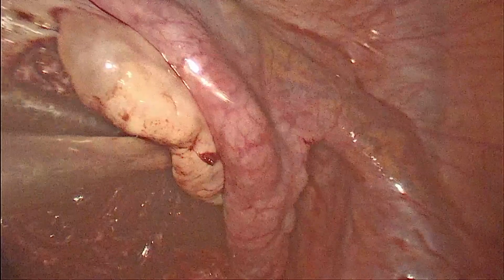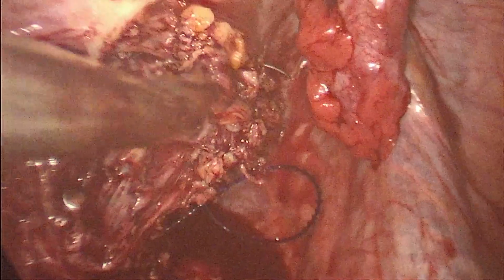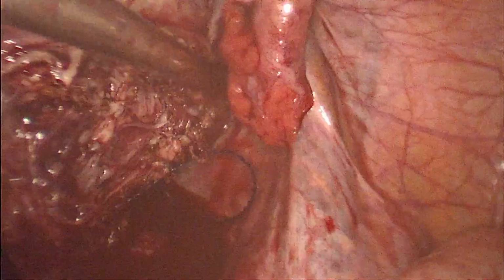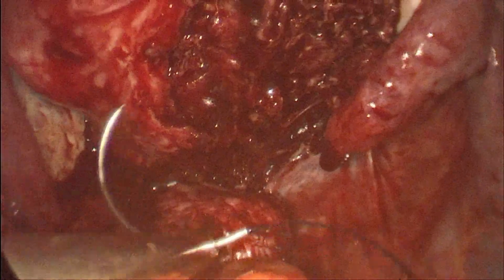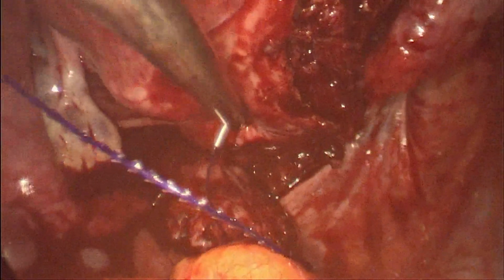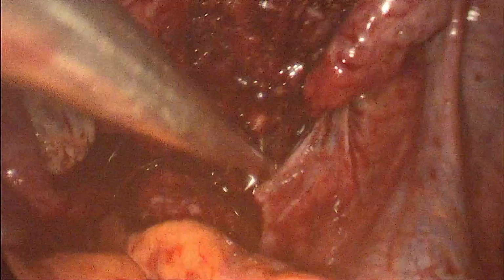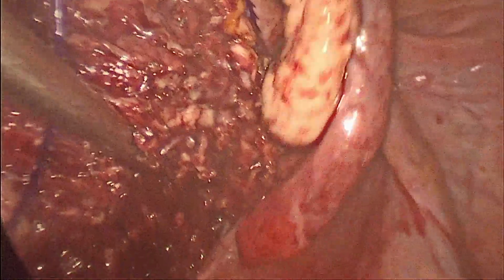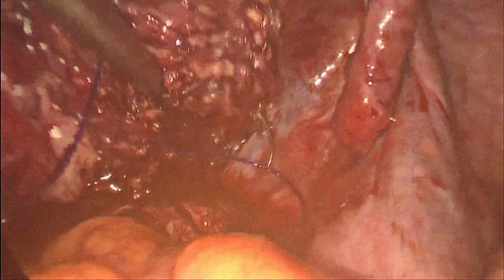Barbed suture is used to approximate the incised ends, and it gives a uniform tension and is easy to manipulate even in a difficult access area like this, where a vertical incision down in the uterus near the isthmus is technically more difficult.